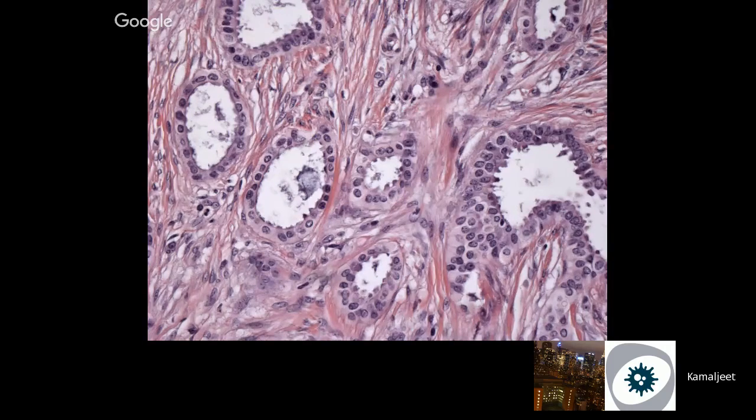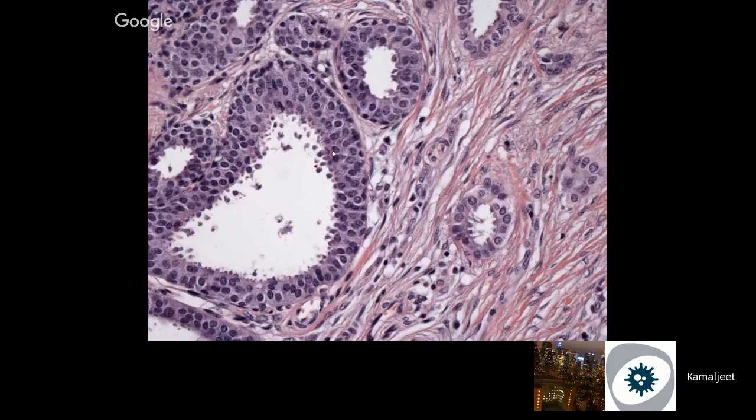More high-power pictures of tubular carcinoma and flat epithelial atypia. I'm not going to show more pictures of this, so they are associated with FEA.